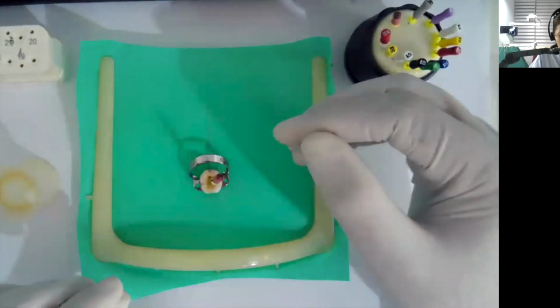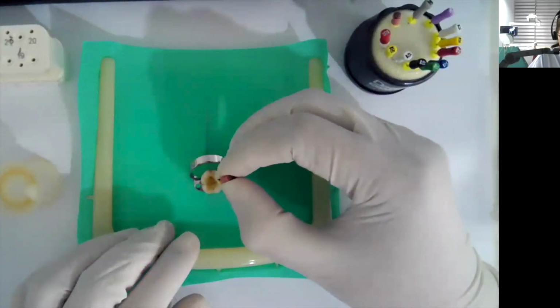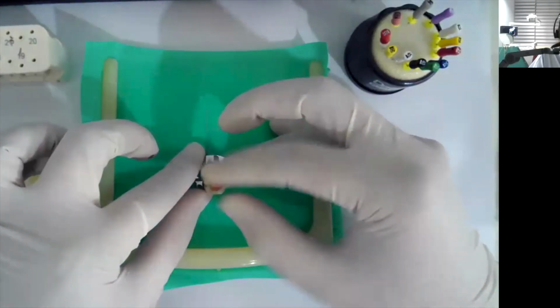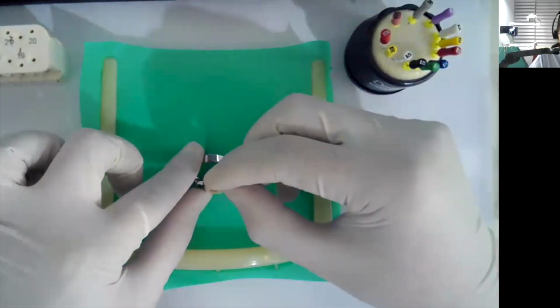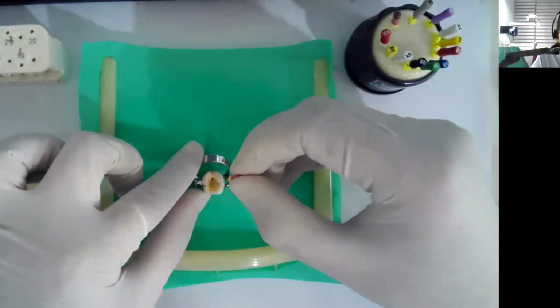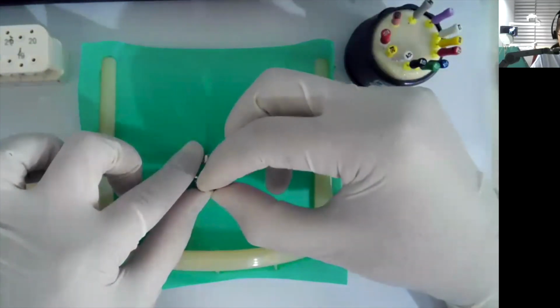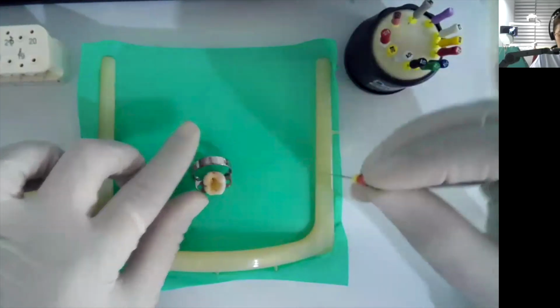I'm going to start first on the mesiobuccal and do the watch winding until it reaches the reference point. It's now reaching my reference point, so the canal is patent. I'm going to do it now on the mesiolingual canal. Okay, mesiolingual, I'm going to do the same. Watch winding, little by little. I'm going down. It's patent.